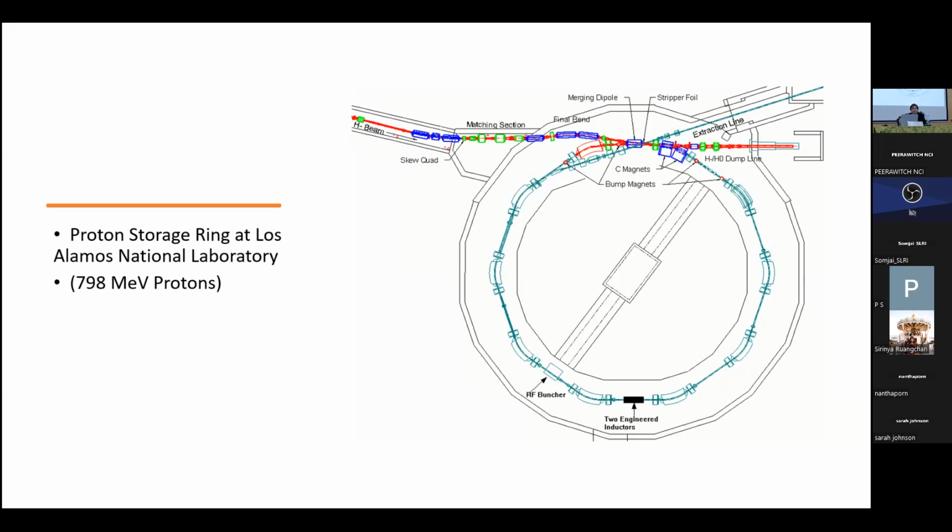But anyways, this is a synchrotron. This one is used primarily to store protons and then used for different purposes. It was approximately 800 MeV. So synchrotrons are used for many different purposes, again, mainly for nuclear and high energy physics.